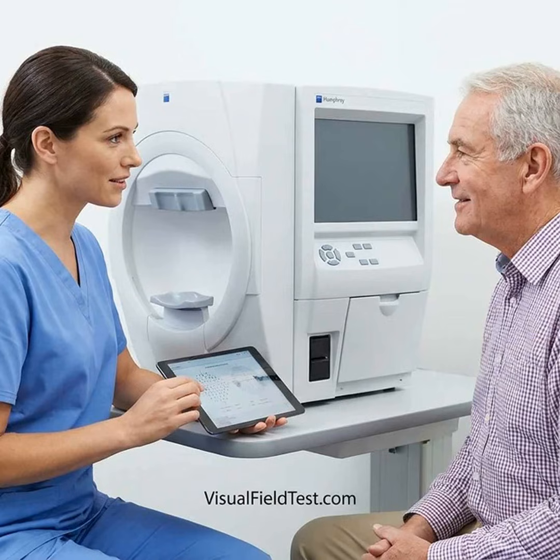The studies reviewed here do not provide a direct randomized comparison between an in-clinic tutor and an application-only educational module before the same clinic-based visual field test. The most practical approach is therefore usually a hybrid model. Provide initial instruction in the clinic, allow patients to review the same material at home, and use reminders or a short practice module before future testing.